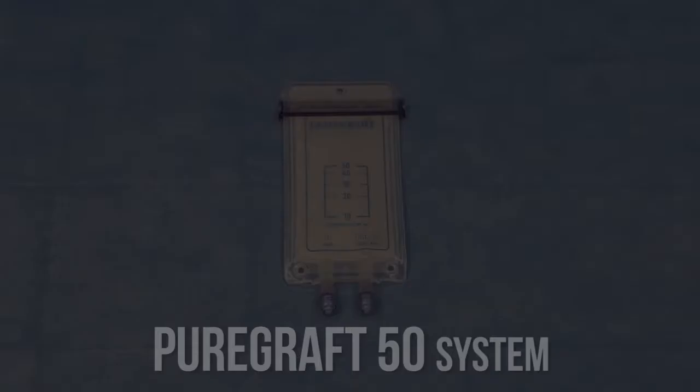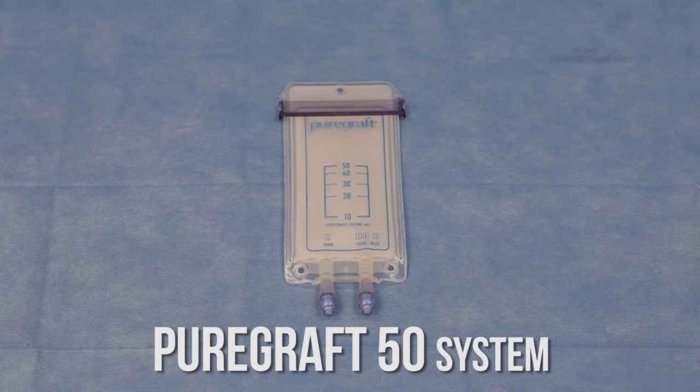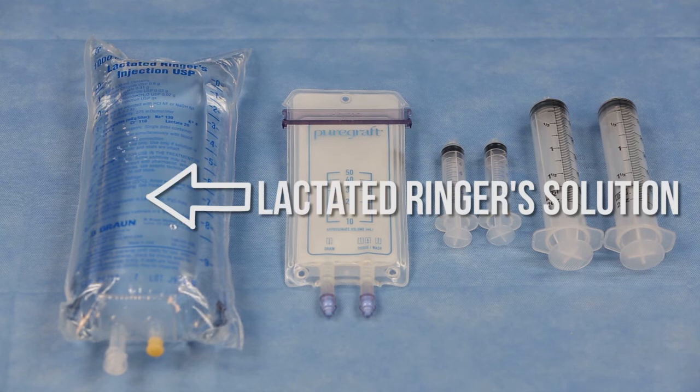It also allows physicians to adjust the hydration level of the graft to best suit their surgical technique. The PureGraft 50 is a sterile single-use filtration system individually packaged in Tyvek pouches. For tissue processing using the PureGraft 50 system, a few additional supplies are needed.